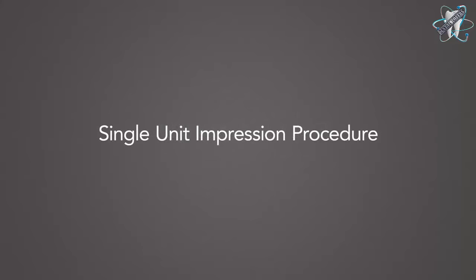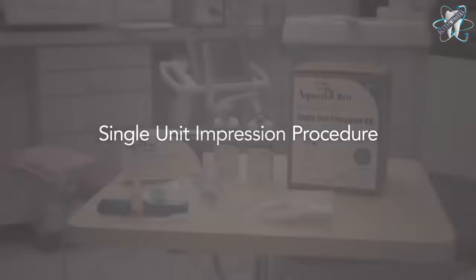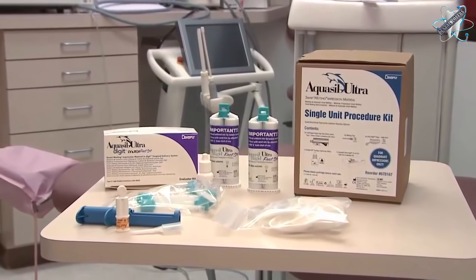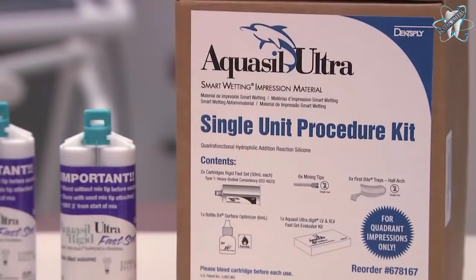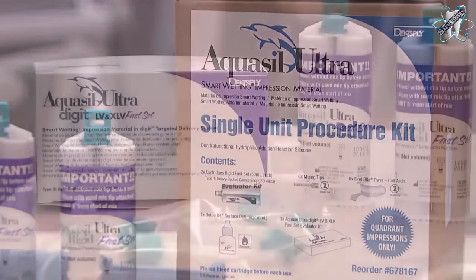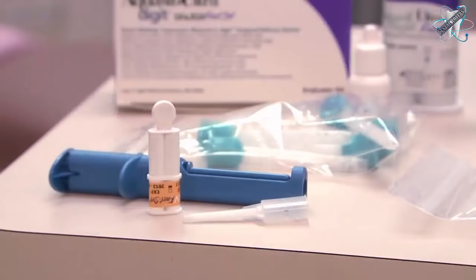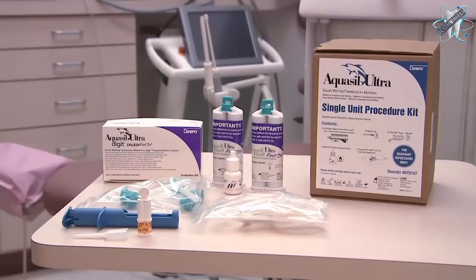This is a demonstration of a single unit impression using Aquasil UltraSmart wetting impression material. The Aquasil Ultra Single Unit Procedure Kit is a unique combination of Aquasil Ultra products designed to work together flawlessly, providing a complete solution for taking precise and predictable single unit impressions.